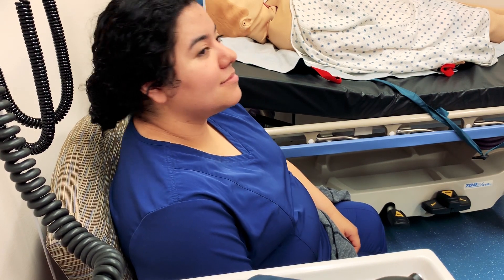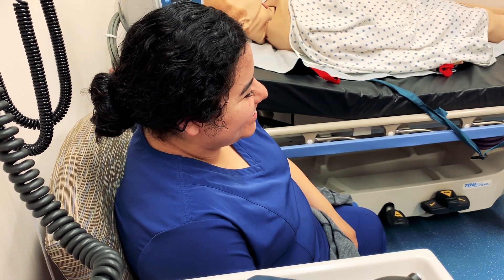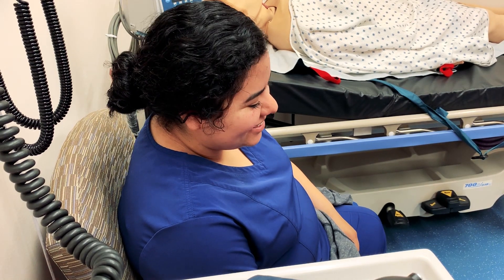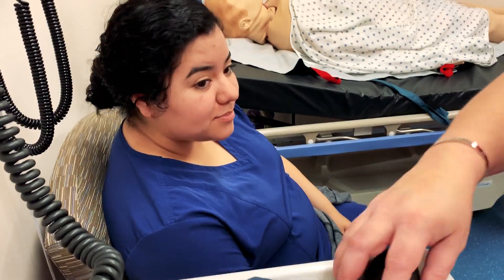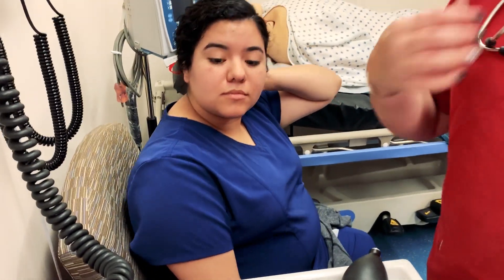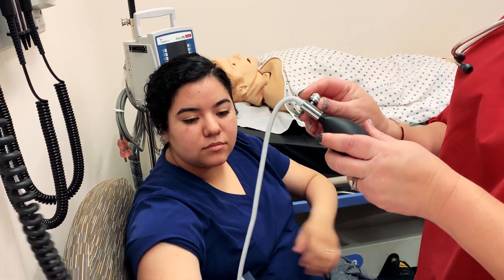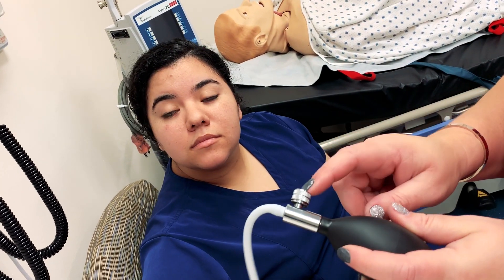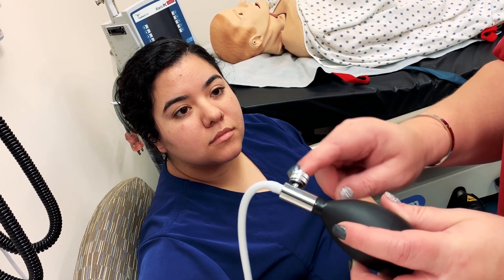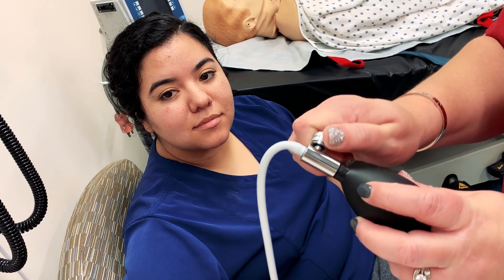Today I'm going to show you how to do a manual blood pressure on Eliana, my patient. A couple of things that are important to note when doing manual blood pressures — the first one is how to work this little dial. This is probably the trickiest part for students to learn when they are beginning manual blood pressures.